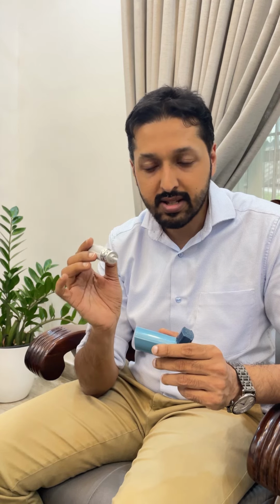As the name suggests, the pressurized metered dose inhaler delivers the metered volume of the drug in each actuation. See, this is a pressurized metered dose inhaler. It has a canister which is filled with the propellant and the active component, that is the drug.